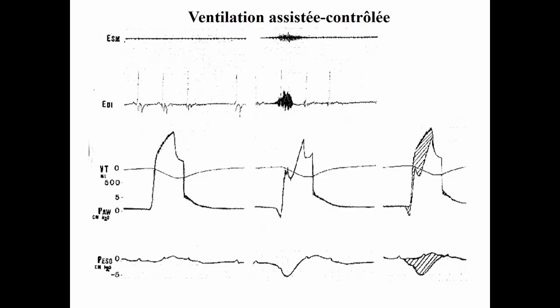Next slide. And it's very important to know that the main reason why patients may have flow starvation during volume control is when the peak inspiratory flow, which is a setting on the ventilator, is not sufficient. You see here an example where the peak inspiratory flow rate is decreased from 55 liters per minute to 45 to 35, and the work of breathing of the patient is increasing. Just think that the patient is not receiving enough, so he's struggling and is really looking bad.